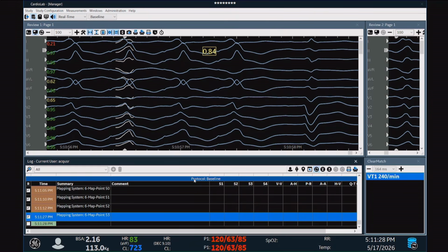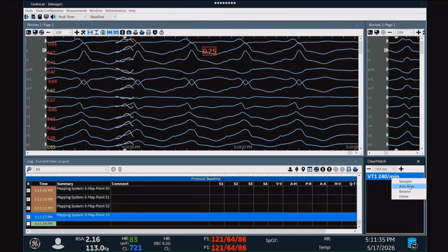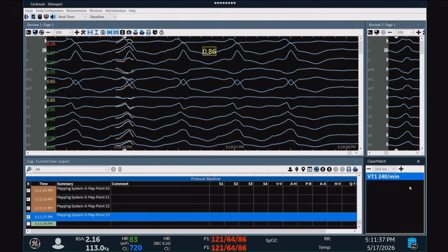On pace it was 90. Yeah, it was 90. This is not perfectly aligned because this is from Pruka. But it's close to the 90, yeah, with the Carto it's 90.